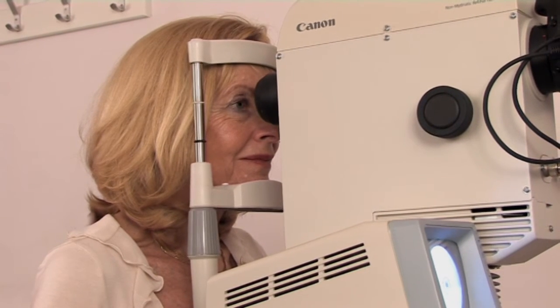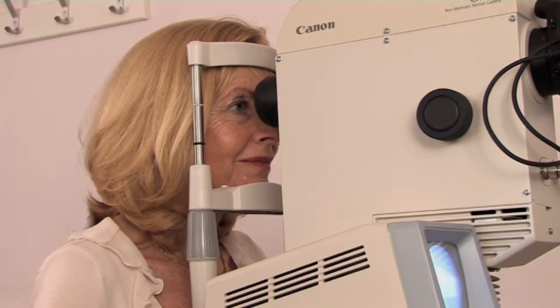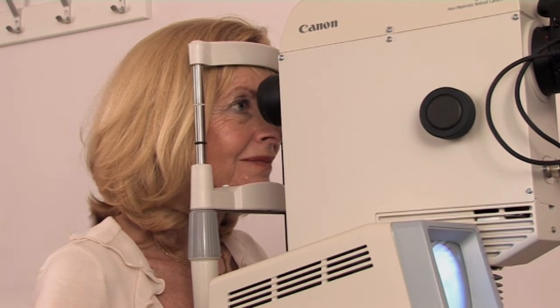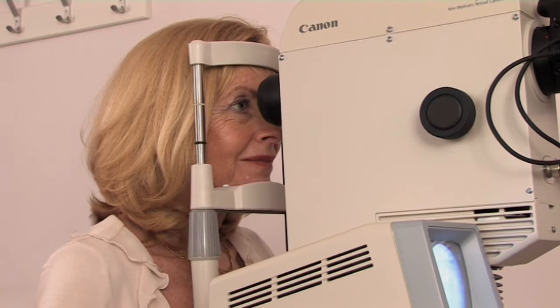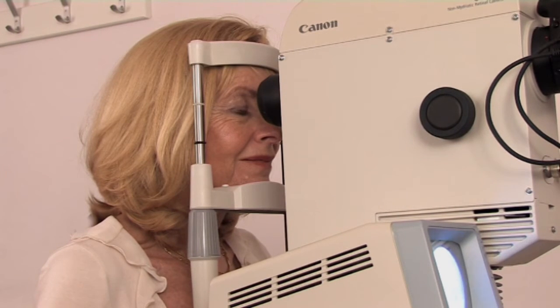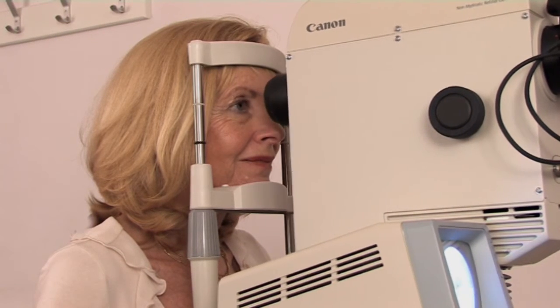Still on the same eye — you're back again with the orange light, and now the little green one again. Just keep watching that little green light, and it's going to move away to the left of the camera. So follow it all the way across. That's lovely. Both eyes nice and wide, hold that nice and steady. Perfect. Okay, so that's that eye done.